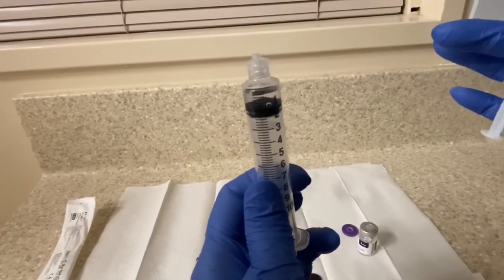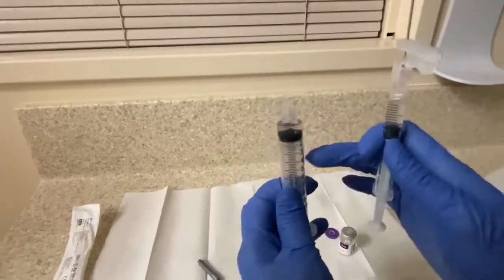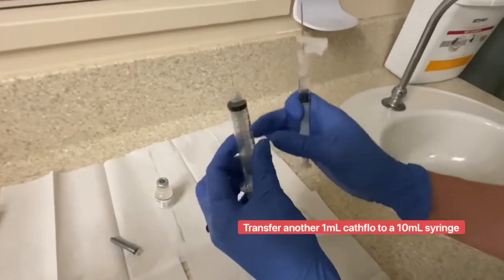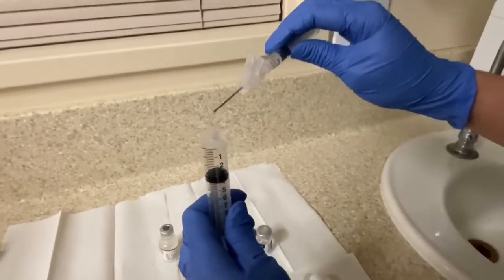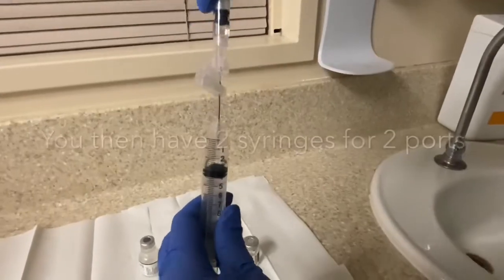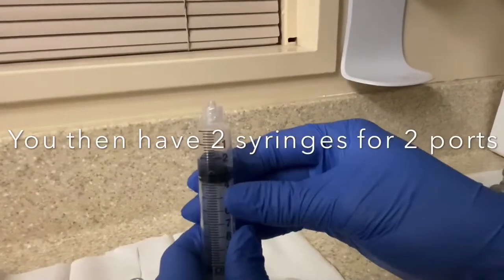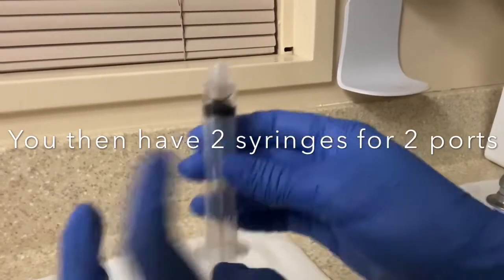Make sure to get all the bubbles out. I can see there's one tiny bubble — before injecting into the patient you want that bubble to go, so keep that in mind. Then do the same thing with the other 10 ml syringe — transfer the cathflow solution over. So basically you have 2 syringes for 2 ports, or you can use the second as a backup if the first doesn't work for 1 port.